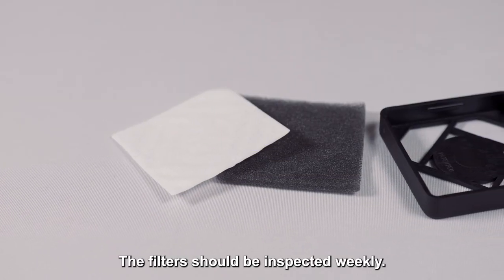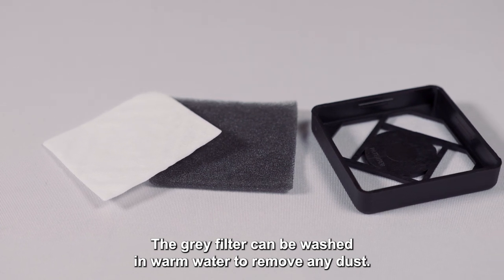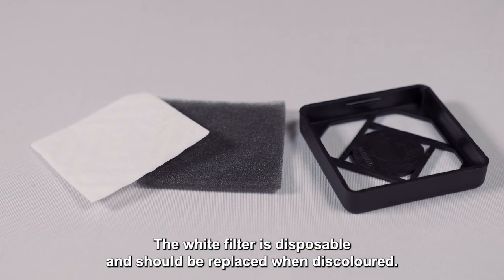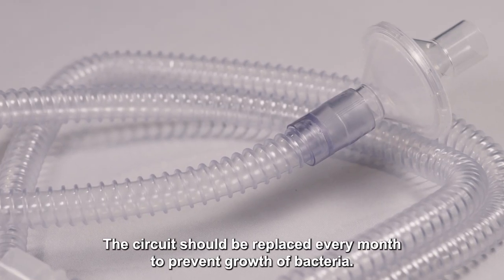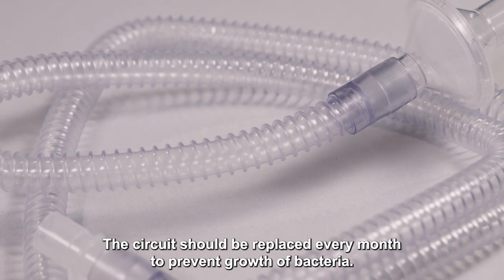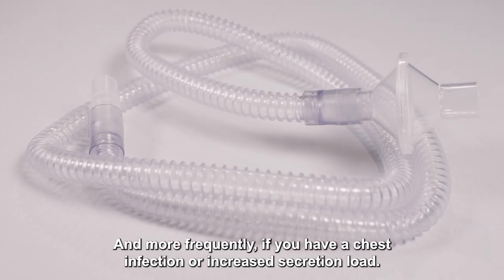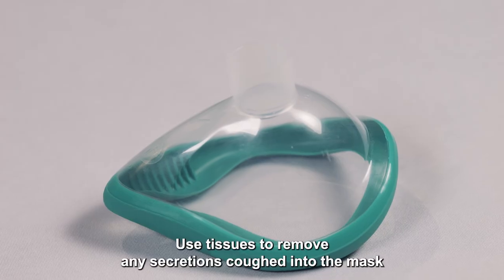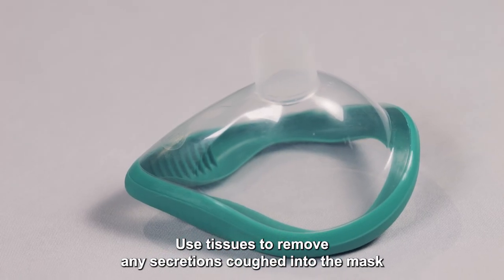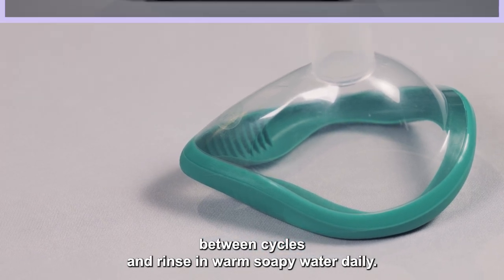The filters should be inspected weekly. The grey filter can be washed in warm water to remove any dust. The white filter is disposable and should be replaced when discoloured. The circuit should be replaced every month to prevent growth of bacteria, and more frequently if you have a chest infection or increased secretion load. Tracheostomy circuits may be required to be changed more frequently. Use tissues to remove any secretions coughed into the mask between cycles, and rinse in warm soapy water daily.